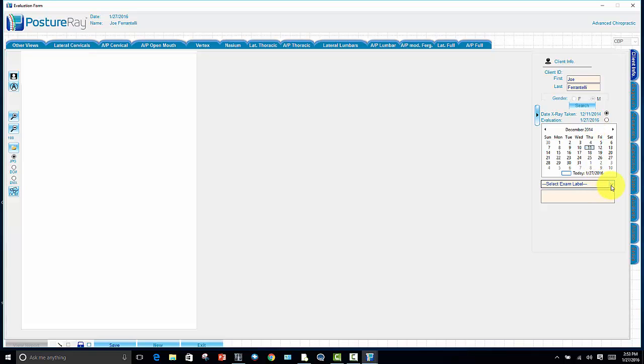And any of these things that you don't understand, remember we have videos on every aspect, and plus we're going to do normal trainings with you anyway, okay, to answer all those questions. The rhyme, the reasons, and the manner that we do things and why we do things.